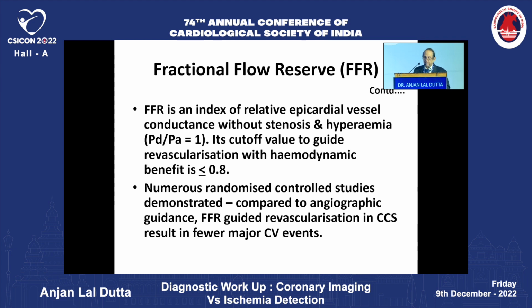So it was initially in terms of coronary intervention that we wanted to know the FFR value so that we look forward to a better outcome. But now it is not related only to outcome of PCI as a medical treatment or as an overall assessment of the coronary arteries. FFR is used in different situations.